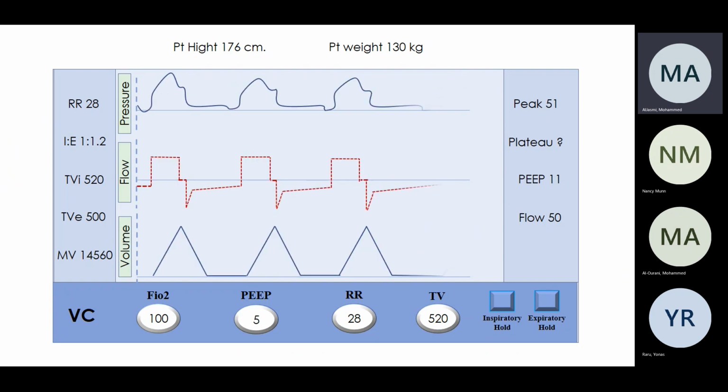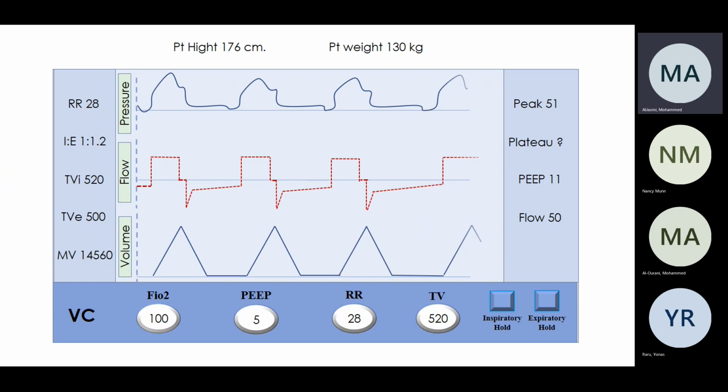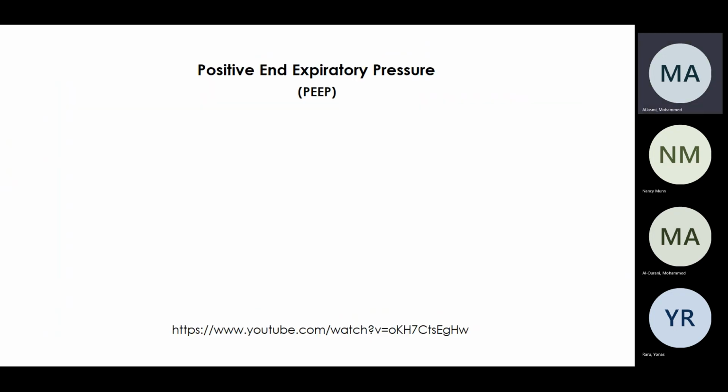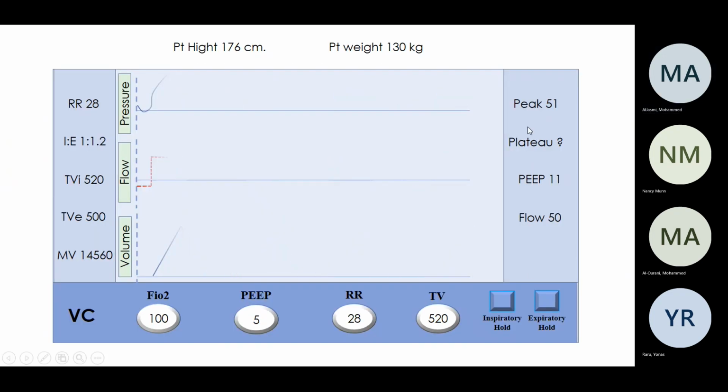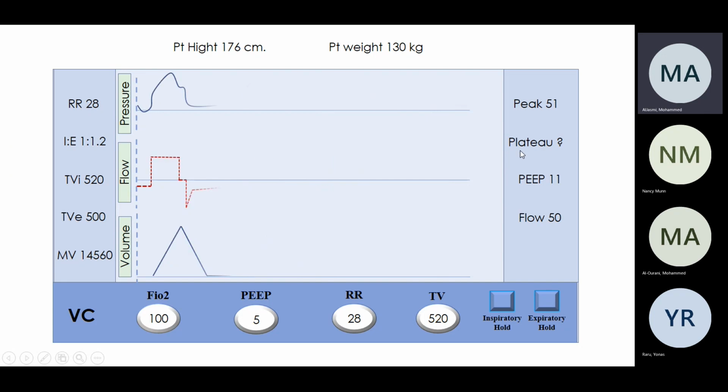But in here, it's high. Is that right? Okay. So what do you need to do to know if it's a compliance problem or a resistance problem? Check my plateau. We don't have it in this one, but you're right.